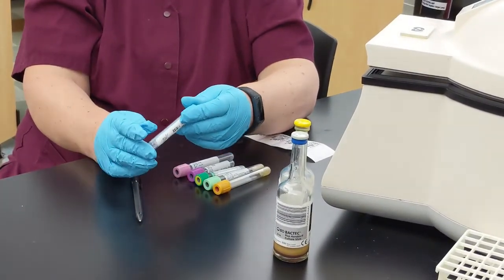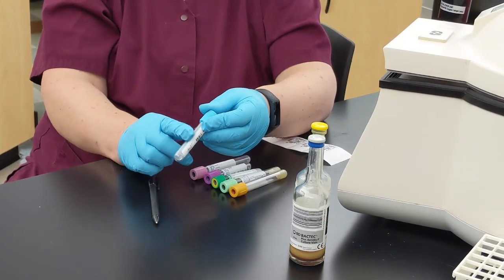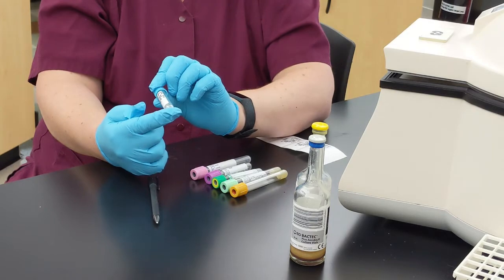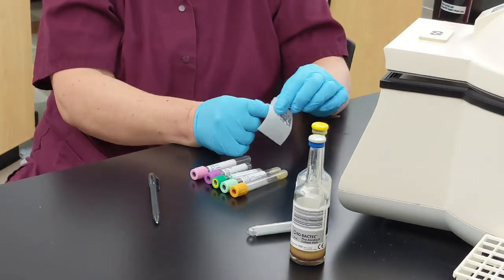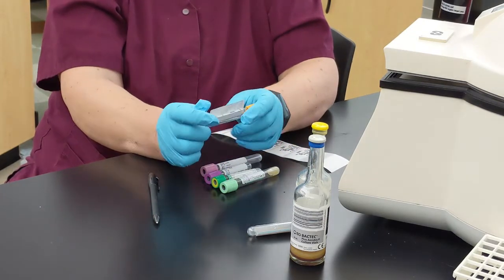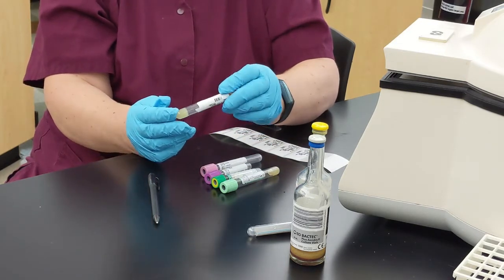You have a nice window to see what the level is. You can see if it's hemolyzed, icteric, or lipemic. You'll appreciate this once you're working with analyzers. Label it in front of the patient — see a little bit of color, nice and straight. There are lots of windows so you can see what's happening in the tube.